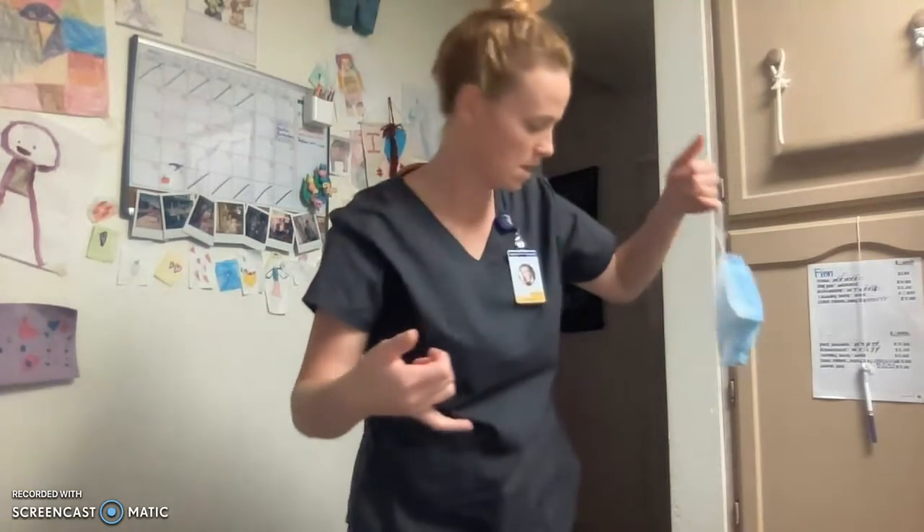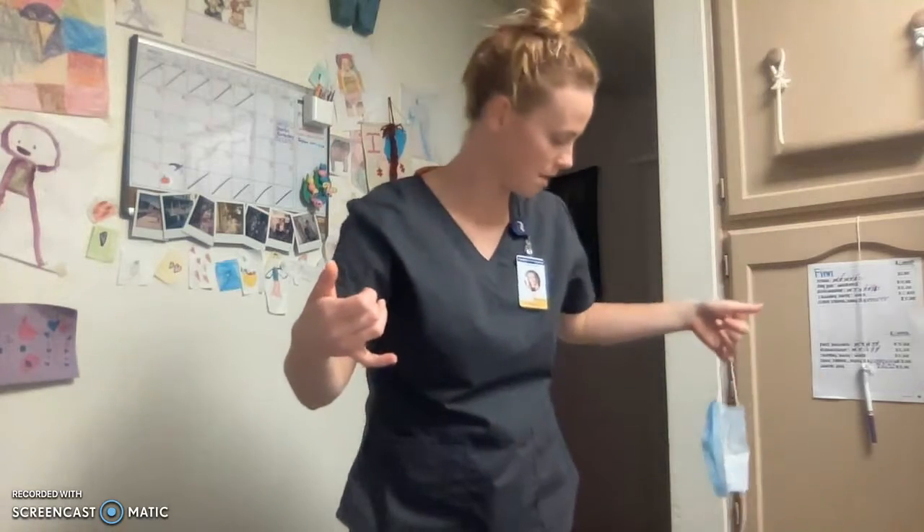Remove my mask. Unhook, pulling it away from the face. Unhook again, disposing it in the biohazard trash. At this point, I will exit the patient's room. Close the door behind me to ensure patient privacy.